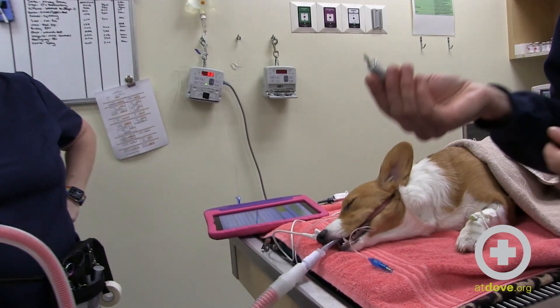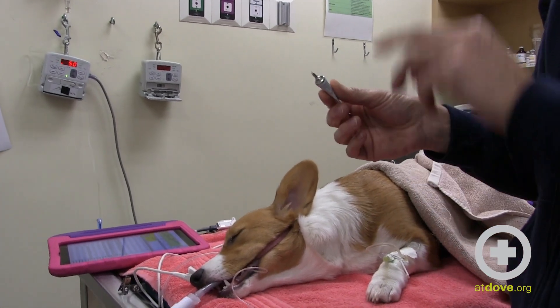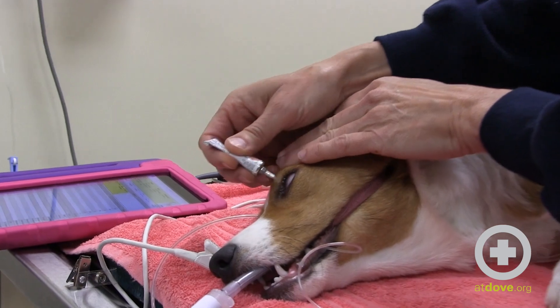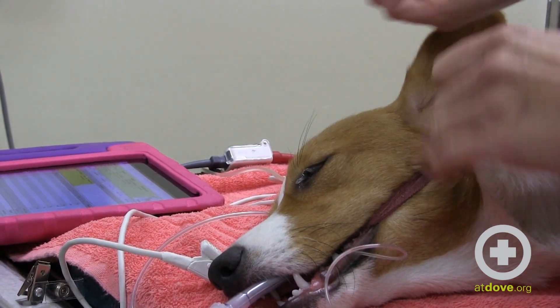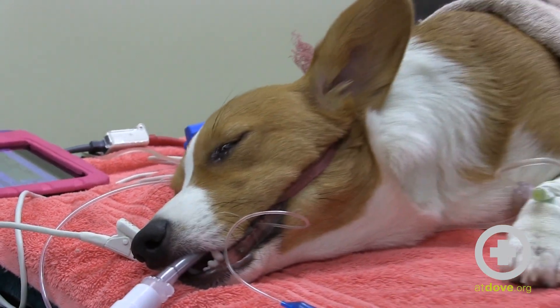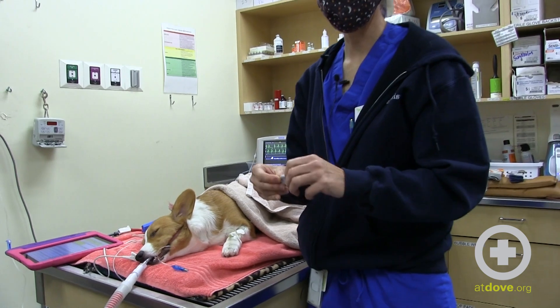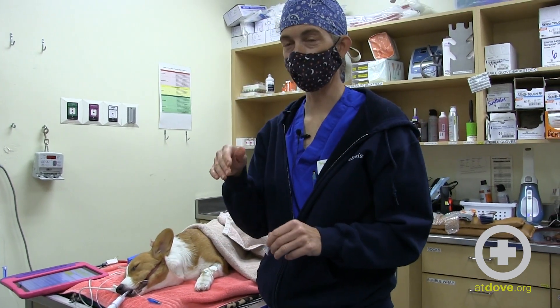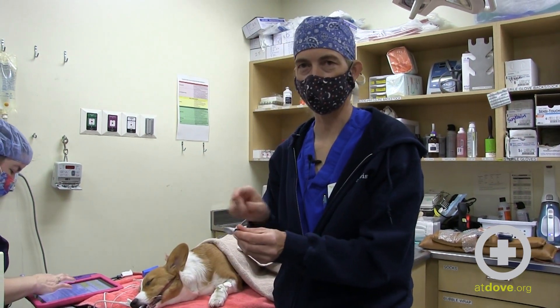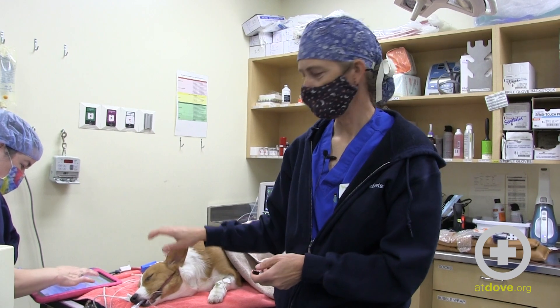So the key things here: we're using a brand new tube. I already took the lid off, and I don't ever want to touch the tip of the tube to the animal. So I'm using my fingers to just pull back her lid — and I'll switch over to the other eye — same thing. This stuff is super inexpensive, so using extra is not a bad thing at all. I would much rather be generous with it and have some goop down her face than not use enough, or worse yet, get so close that I touch the metal tip to the animal. We never want to risk any sort of corneal injury with the tip of this.